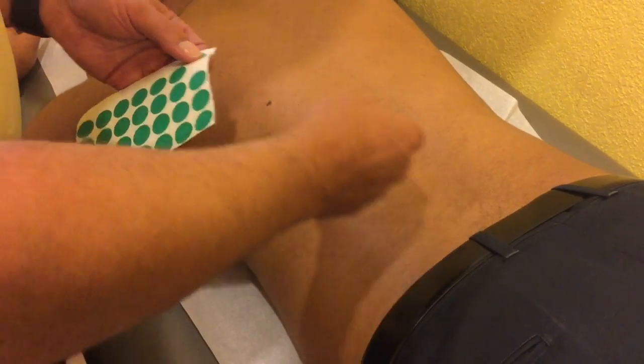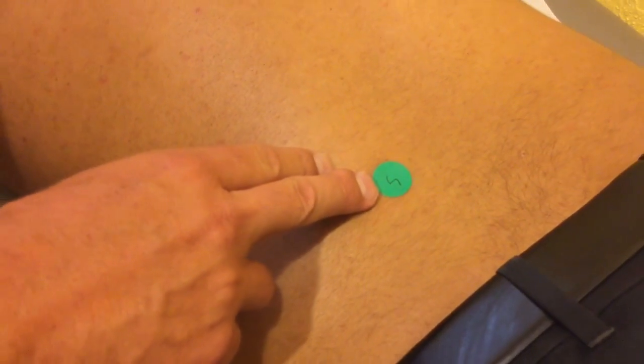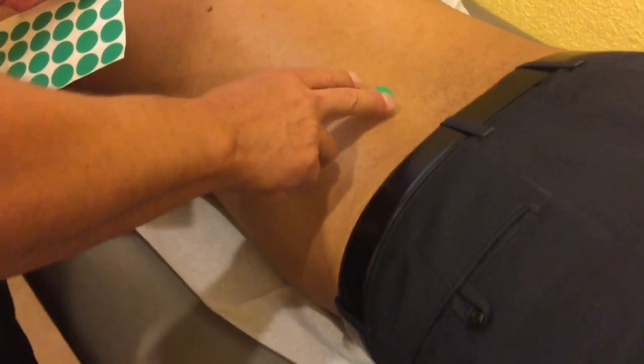Yeah. Okay. So we found the symptomatic site. Patient is rated at 8 out of 10. We're going to use that number to enter into the test for the VAS score for pain.